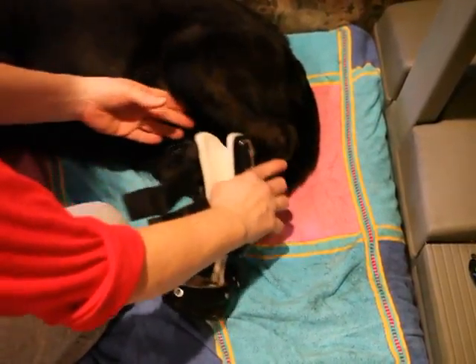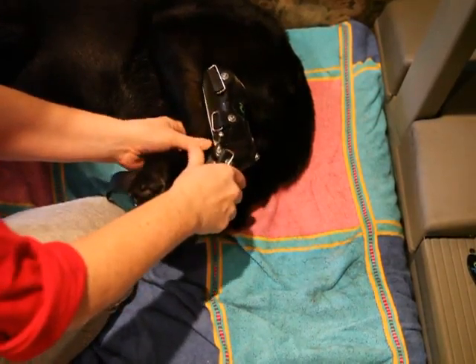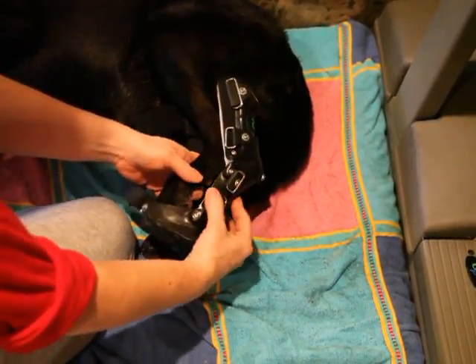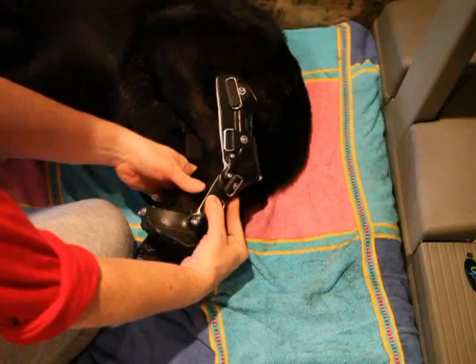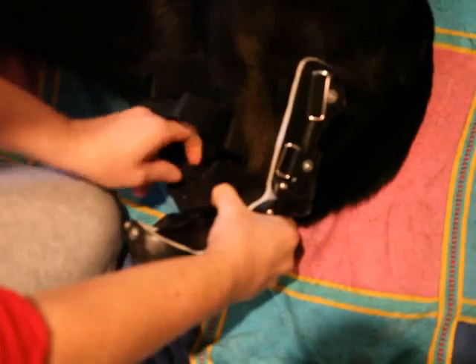I'm putting on Cleo's left brace, and this is the one that really seems to trouble her when her foot goes in. You can see she really has a hard time getting her foot pushed back into that lowest strap.